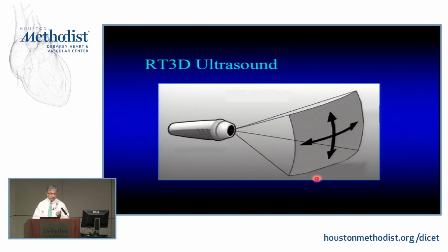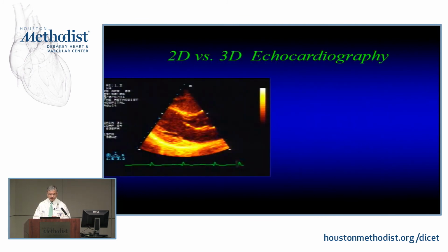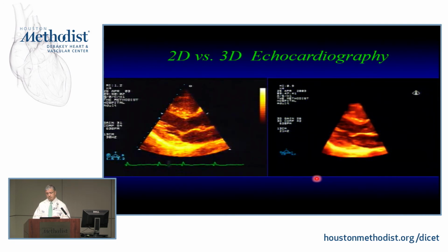And 3D came on board, my goodness, about 15 years ago now, certainly refined over the past 10 years, even more so over the past 5 years, and adds another resolution, which is the interplanar resolution, in addition to what's called azimuthal resolution, in addition to the axial and lateral. Nowadays, I think with the refinement of technology, you could take a look at the 3D of a heart in almost single beat, really a truly real time, unlike in the past.